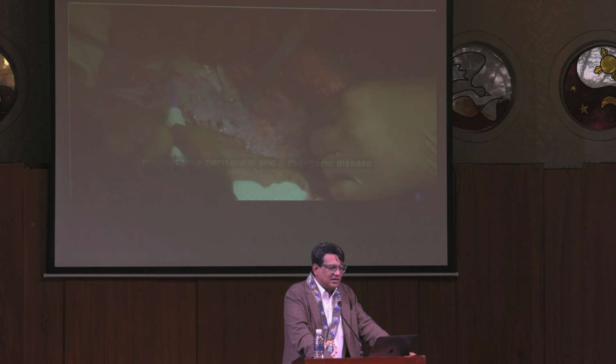This kills the microscopic cells, the cells we cannot see with our naked eye, through direct contact. It can penetrate up to 6 millimeters. There is more on this later, but I won't show you the gory details.